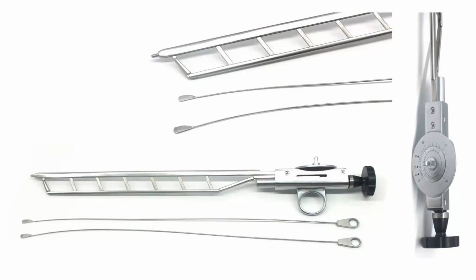Can you do VIU, visual internal urethrotomy, with Otis? Otis urethrotome is not used for cutting anything normal. Already sir has told, it will cut only the narrowed or fibrotic or ring area, and that cutting is only up to 3 millimeters.